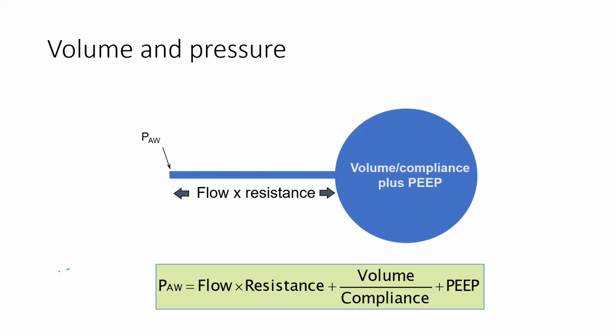So looking at this diagram, you will understand that there are two different types of pressures generated during mechanical ventilation. One, to distend the alveoli against their tendency to collapse, and another to overcome the resistance in the tubes. Now, passing the tube is just the way.